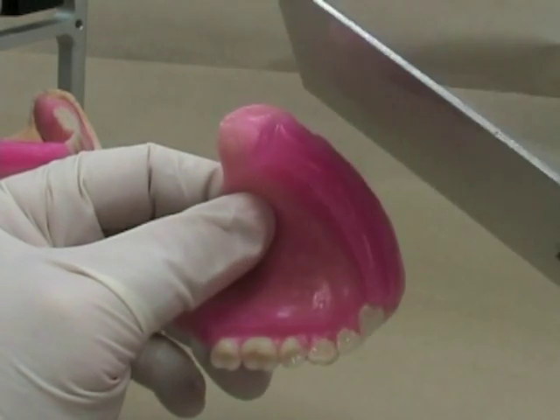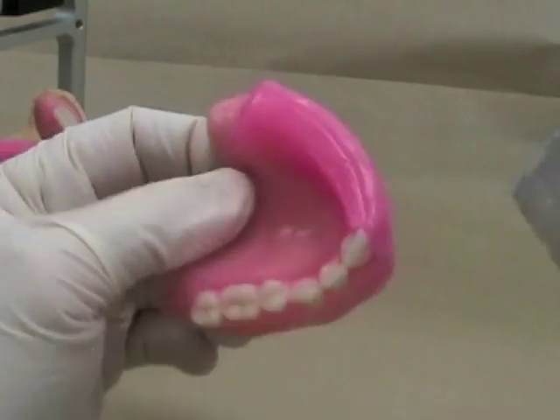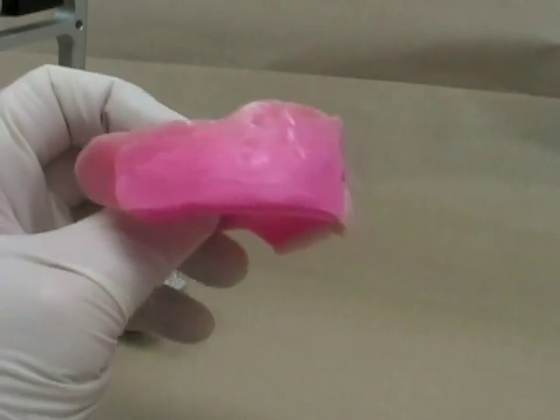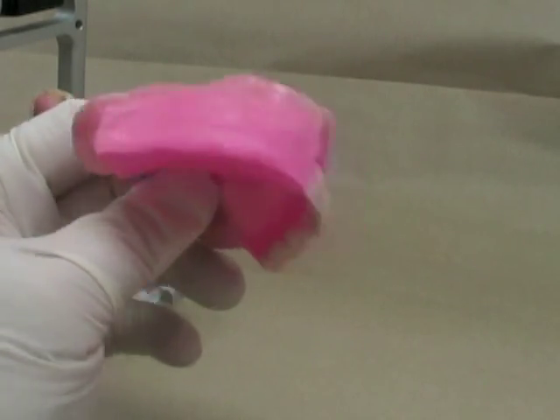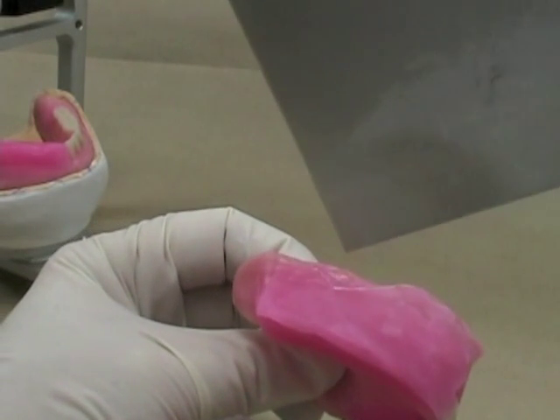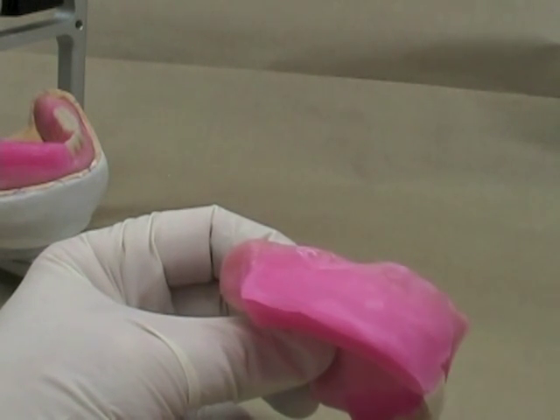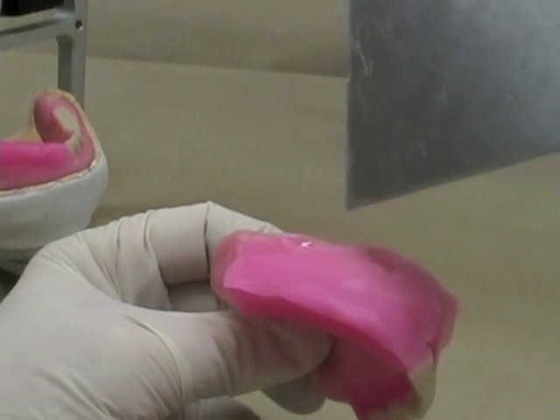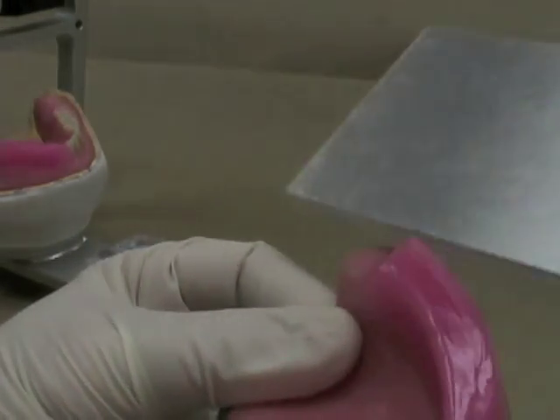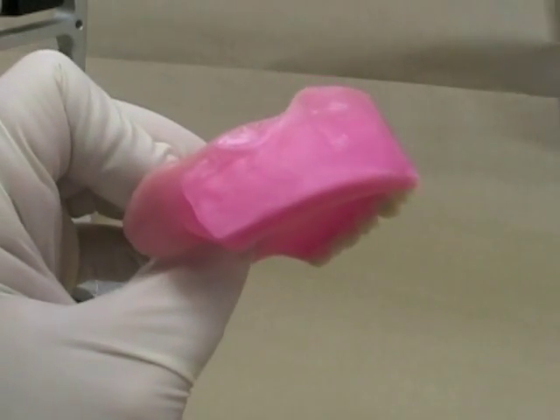Where I've added that wax to the maxillary rim, I'm going to take my wax forming instrument and heat it up on my Bunsen burner or butane torch. If you've got a Hanau torch, it won't be quite hot enough to do that. You want to try and get that nice and smooth and even, blending with the rest of the rim. You can use a little bit of the wax that drips off the end of it. Make sure that you have your instruments hot enough that it causes the wax to become molten, and then you can smooth that off so that you have a nice, even and smooth wax rim.